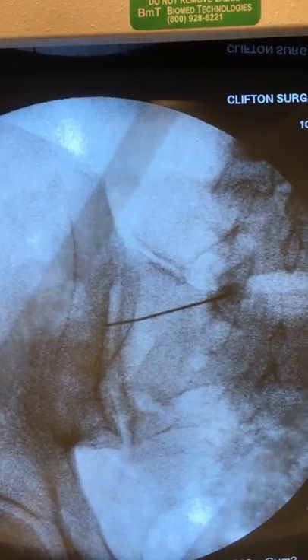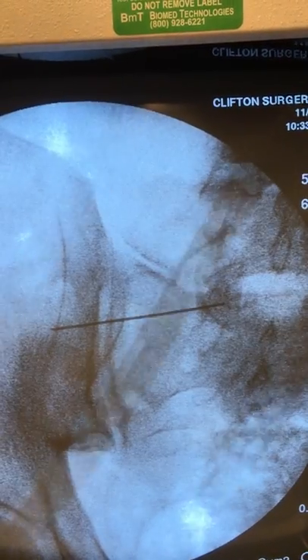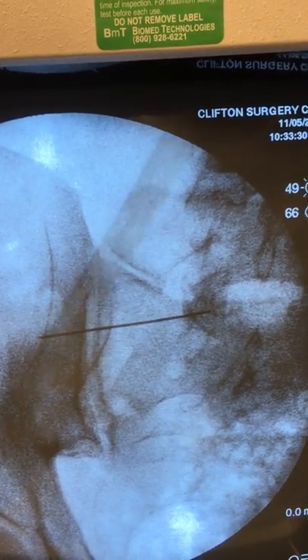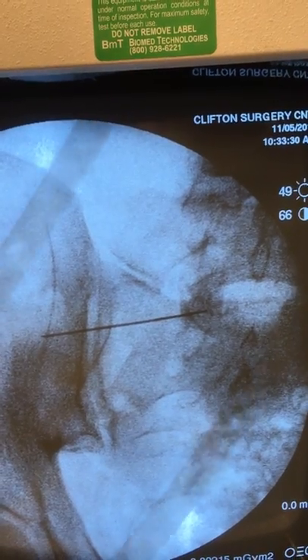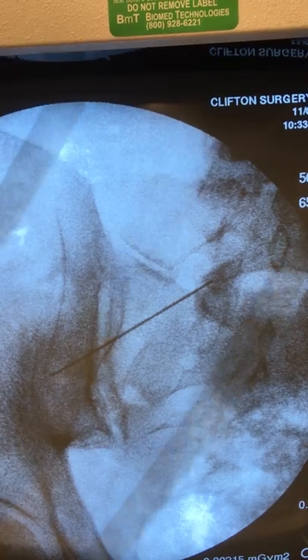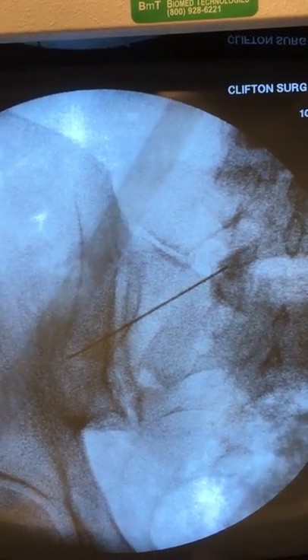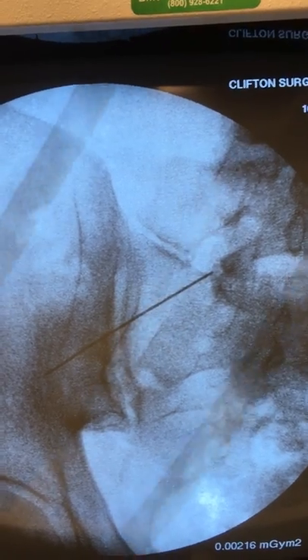This is a diagnostic injection with some corticosteroid. Patients can have temporary but also long-term relief. If the pain does return, I have successfully treated many patients with radiofrequency ablation to achieve long-term benefit.